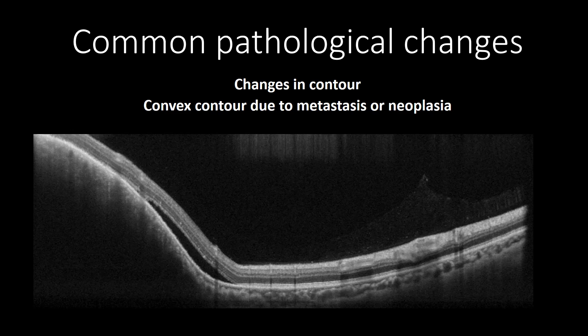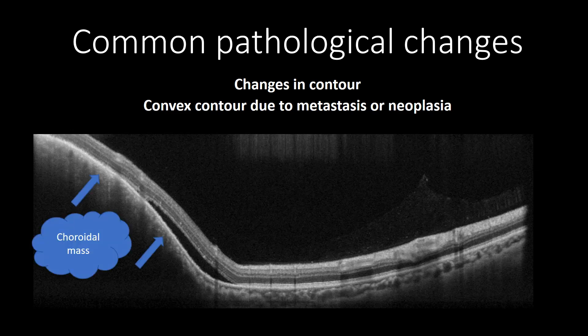This OCT cross-section shows choroidal metastasis from breast cancer, appearing as a hypo-reflective mass pushing the retina and changing the retinal contour into a convex shape, along with the presence of subretinal fluid, which may indicate exudative activity from the metastasis.